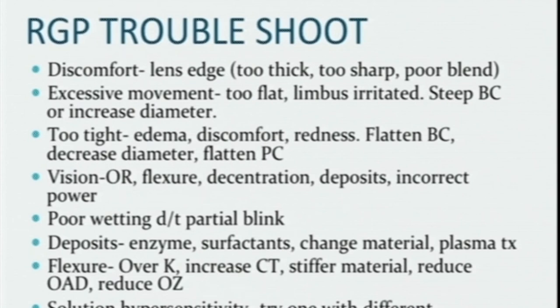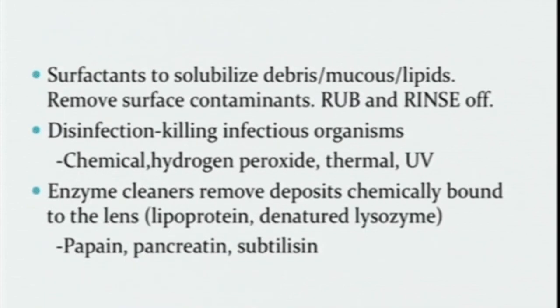The lens care products should be concentrated on, because usually they won't change the solution in the lens case. So it has to be mentioned to the person and highlighted. The best disinfectant is hydrogen peroxide. At times it can be used or change the lens, but examine the lens under the slit lamp if possible, if the patient gives any complaints regarding that.